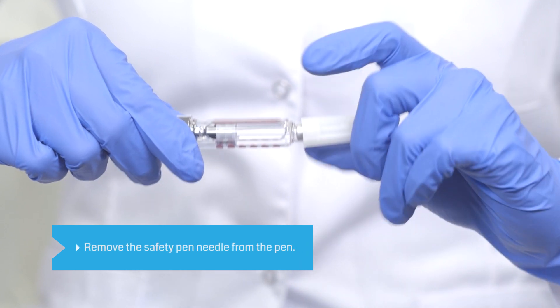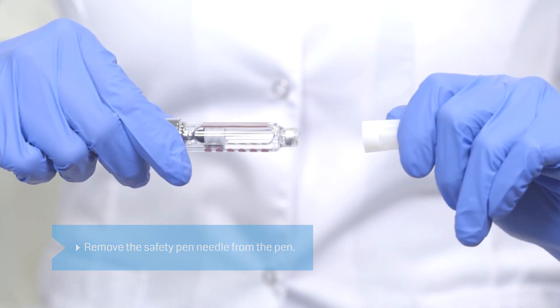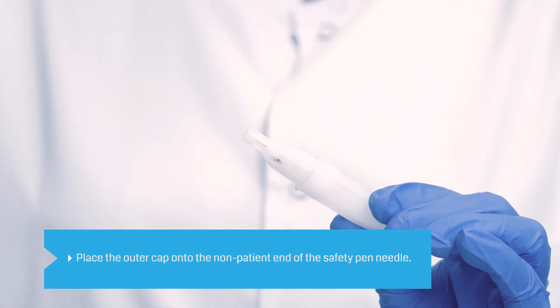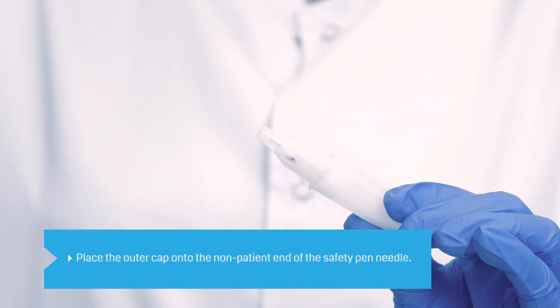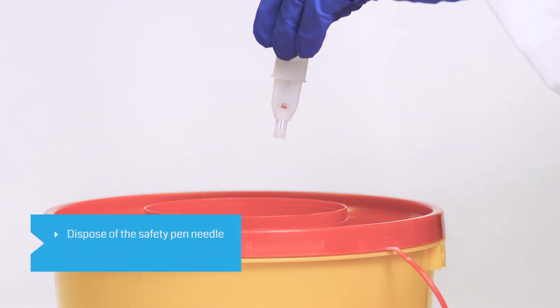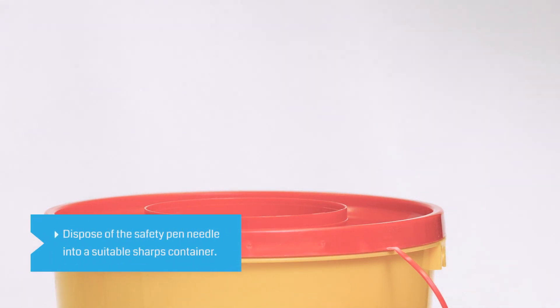Remove the safety pen needle from the pen. Place the outer cap you set aside onto the non-patient end of the safety pen needle to add protection prior to disposal. Dispose of the safety pen needle into a sharps container in accordance with your local regulations.